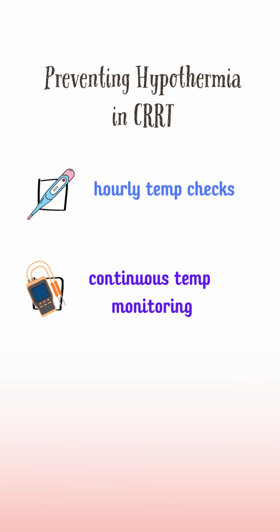Most protocols will recommend hourly temperature checks, advancing to continuous monitoring if temperature drops below normal. There are blood warming devices, external warming blankets, and heating pads that can also be used to raise the core temperature.